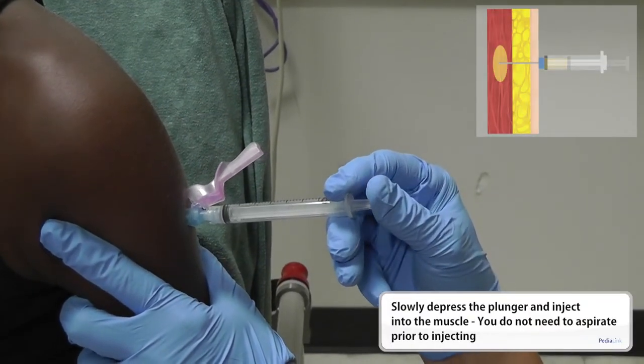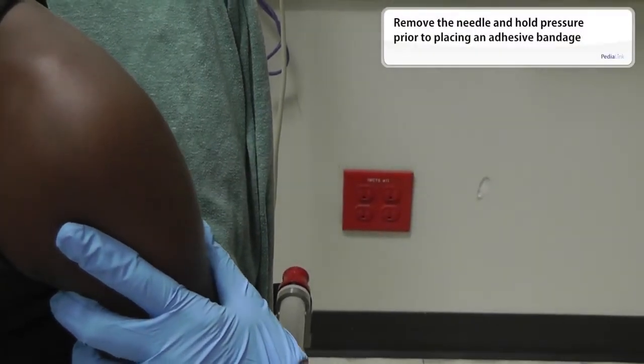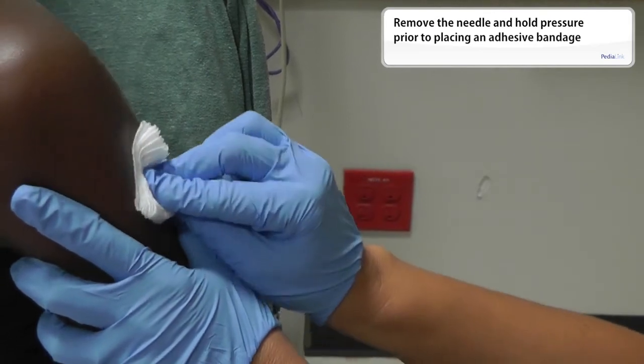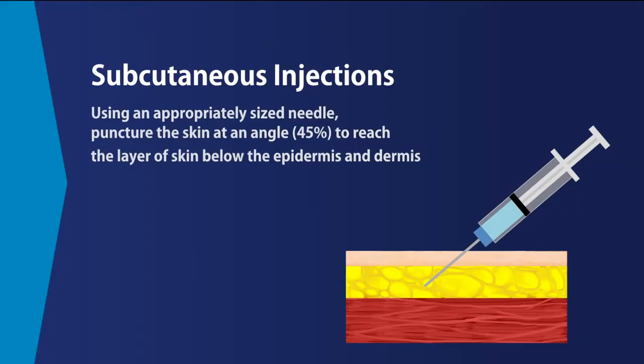Then, slowly push the plunger to administer all of the injectant. Next, remove the needle and hold pressure with a cotton ball or gauze. And finally, place a bandage over the injection site.